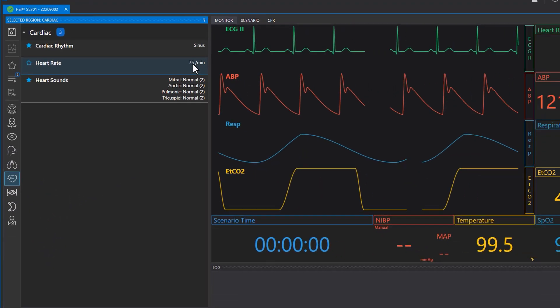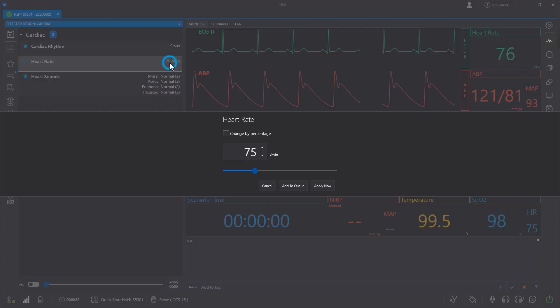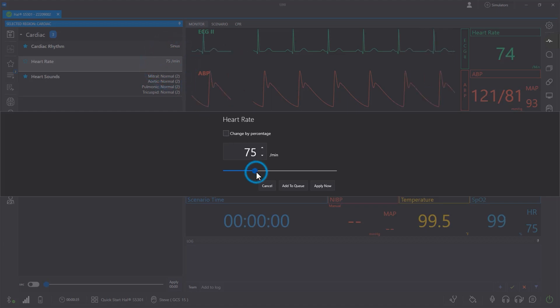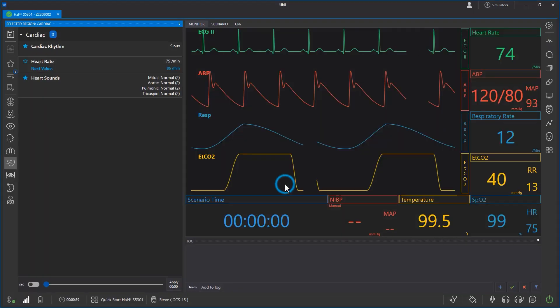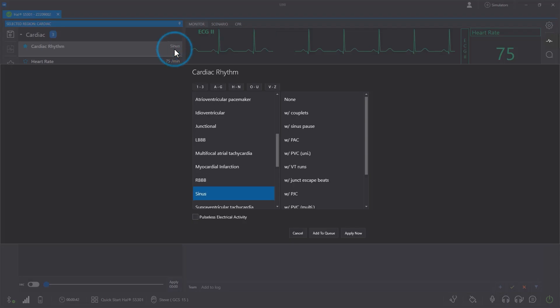To make a change, click a vital sign, then type, move the slider, select from a list, or click the on or off button. Then, choose whether to apply the change immediately or to add it to a queue.